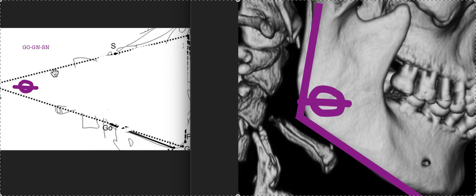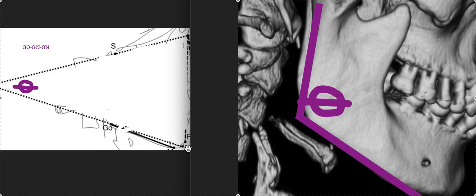And then this is the gonial, that's this point right here. And it's going to be menton, which is the very tip. That is your mandibular plane angle. The GOGN-SN is just a little bit different. It's going to go to gnathion, which is right here. But it's pretty much the same thing.